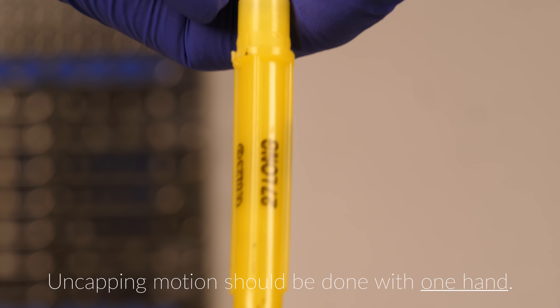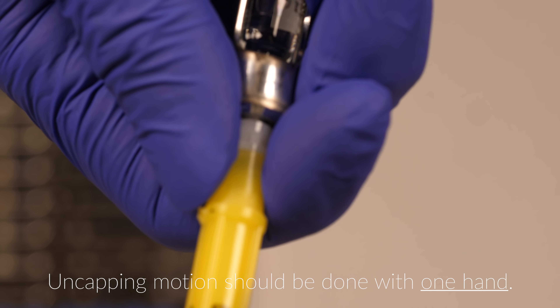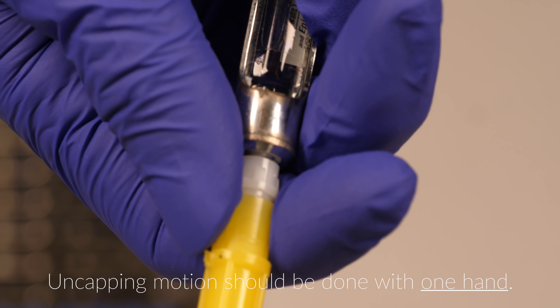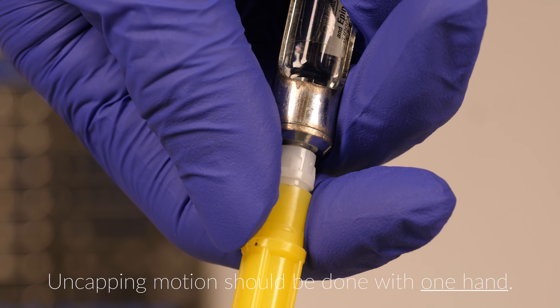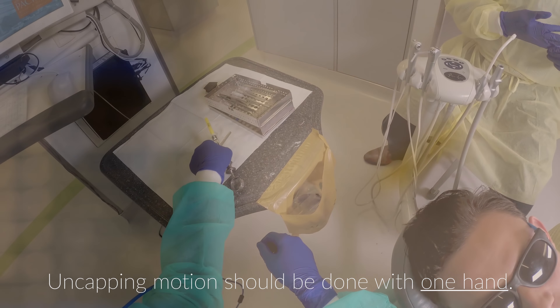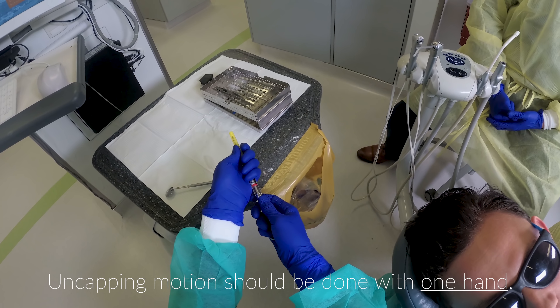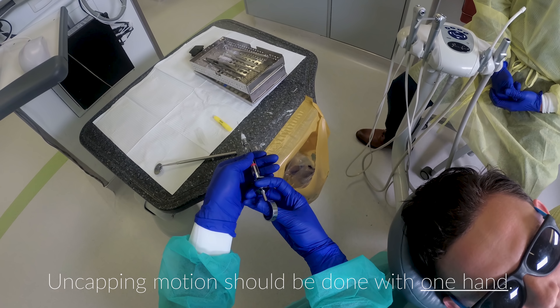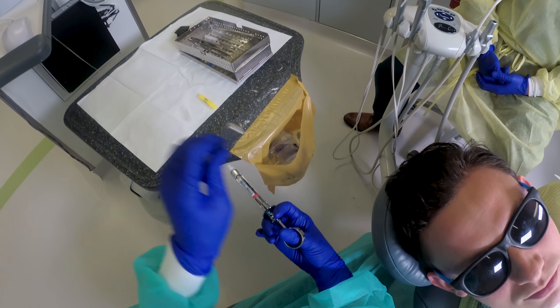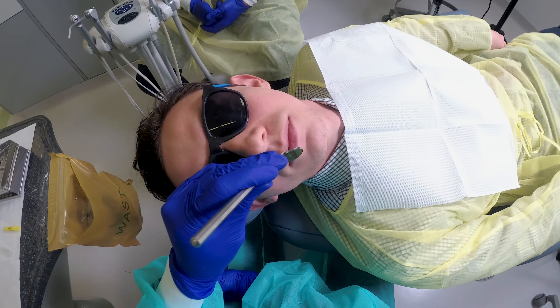It is advised that you uncap and recap the needle by yourself in two steps to avoid accidental needle sticks. To uncap, loosen the cap of the needle, pull the needle away from the cap, and proceed with the anesthetic delivery.